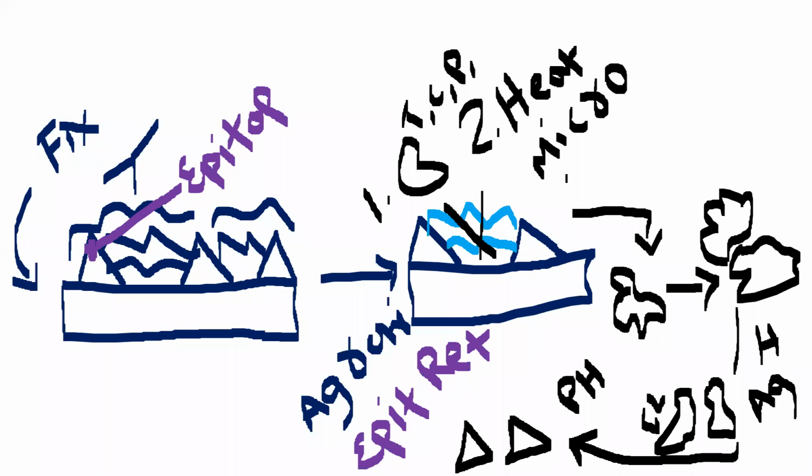The problem with microwaving is that when we subject the tissue to microwave heat, it will cause hot and cold spots in the tissue. The heat won't be spread evenly. Some parts of the tissue will be very hot and some parts much less hot. We also need to mind that excessive heating may destroy the tissue, so there should be no excessive heat spots. So microwaving is not an ideal method of inducing heat into the tissue.